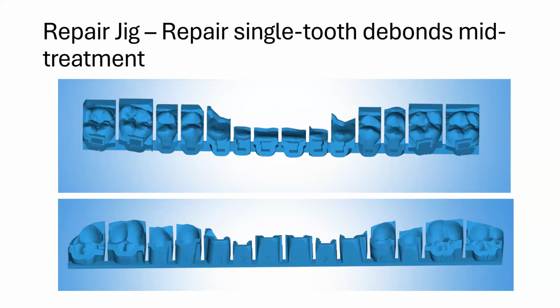Excellent. A couple more questions have come in. What is the learning curve to learn the DIBS software program, and how much time do you spend on a DIBS setup per clinical day?